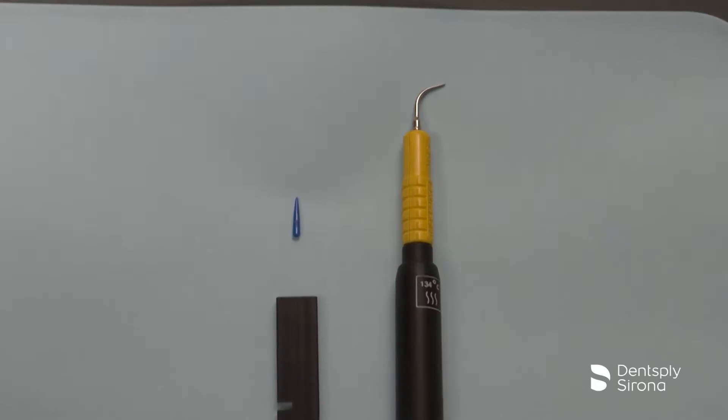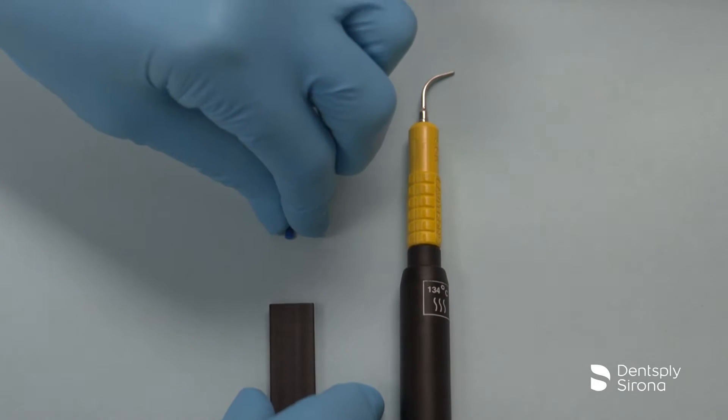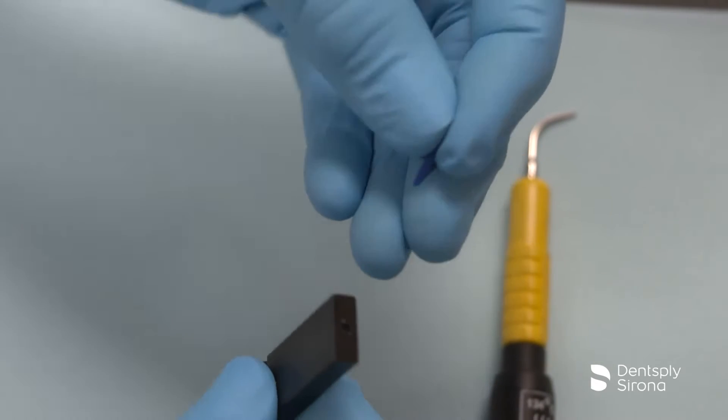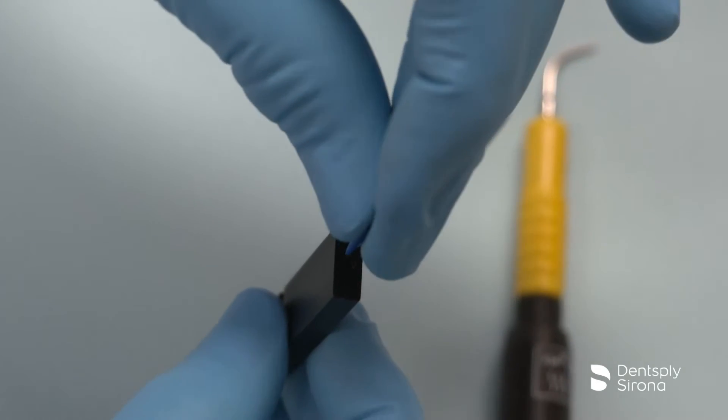To prepare the Cavitron Ultrasonic Implant Insert for use, take a new plastic Soft-Tip Disposable Profi-Tip and place it point first into the hole in the end of the wrench.